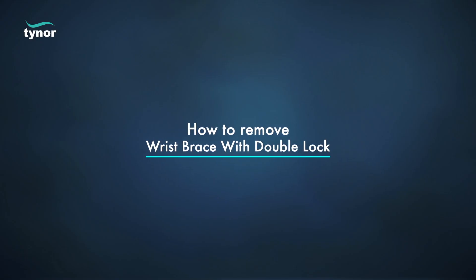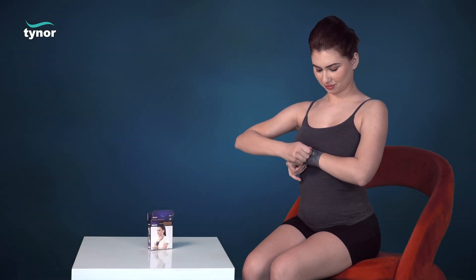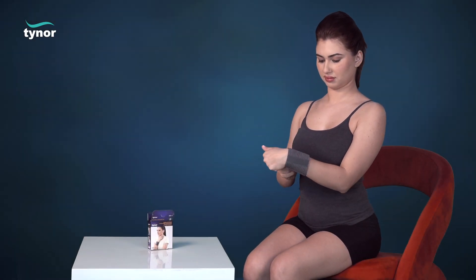Now let us see how to remove the wrist brace with double lock. Disengage the fasteners to easily remove.